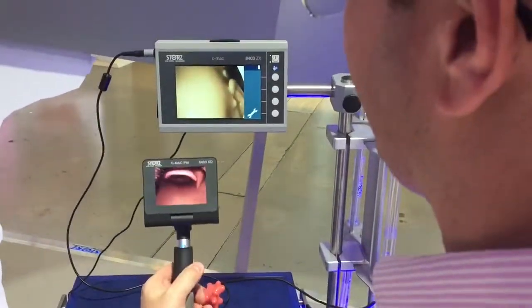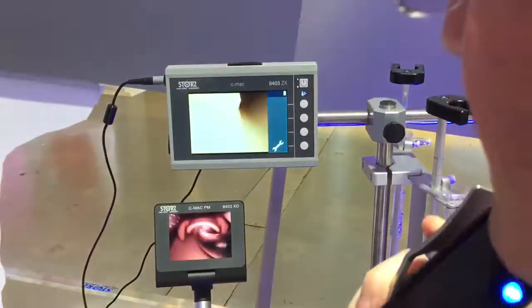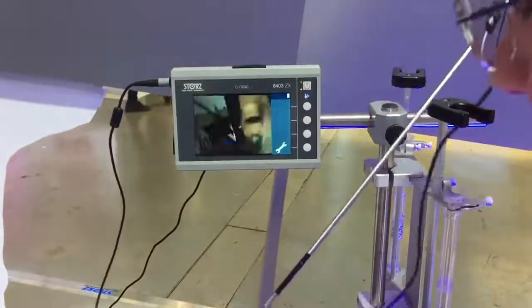If you do your laryngoscopy and you're able to achieve a reasonable view, now your optical or video stylet becomes just an introducer to put the tube in. There goes the tube in — I can either have my assistant railroad it off or I can advance the tube, and I've got confirmation that the tube is placed.